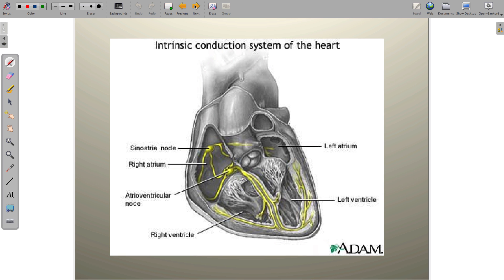So far we've looked at the sinus rhythms and the atrial rhythms — those that originated in the sinus node or in atrial tissue. Now we're going to look at rhythms that originate at the level of the AV junction — the tissue that surrounds the AV node.